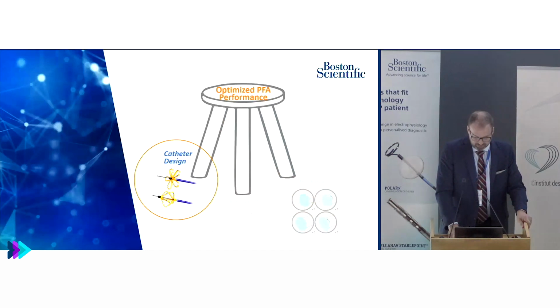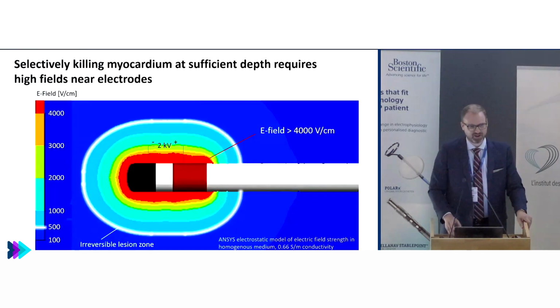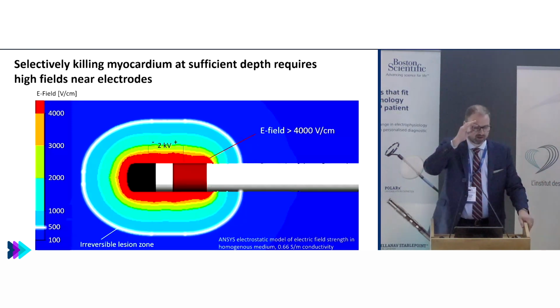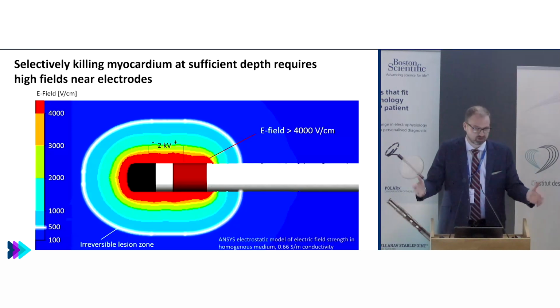Okay, just real briefly on catheter design. And we've been talking about a lot of weird things that we don't understand with PFA, such as why is there any phrenic nerve paresis, transient paresis? And as Professor Jai mentioned earlier, that one case that Jim Hansen had in Copenhagen has actually resolved. So as far as I know, I don't know of any permanent case, and you may know there may be one.